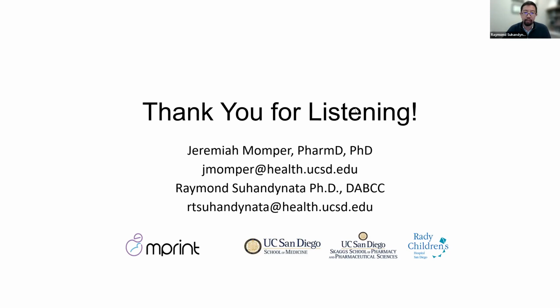The industry's take on the paper spray is that it can be accurate. For instance, we actually have a couple of collaborations that are looking at dry blood spot sampling for newborn screening, and that is very robust. So I think it depends on the analyte. The issue with dried blood spots is getting consistent collection, right? I hope that answers your question, in the sense that we are not currently doing it right now, but if it's something that comes up, we could.